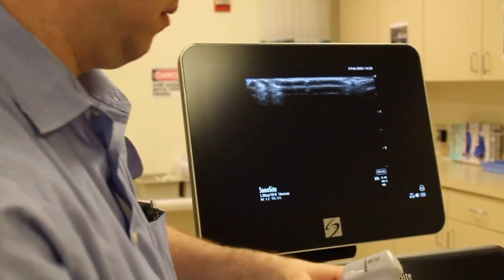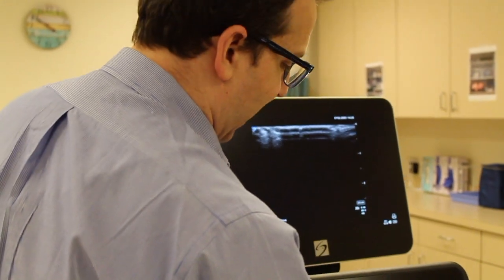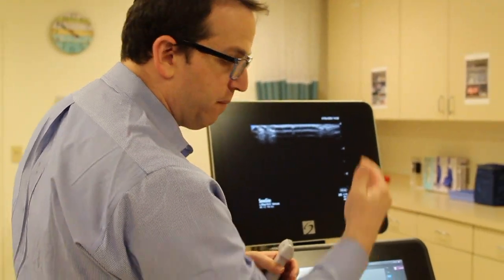So those are the basic buttons: your depth, your gain, your color, and the M mode which drops that midline. Those are the basics of using the ultrasound machine that you'll need to review for your labs.